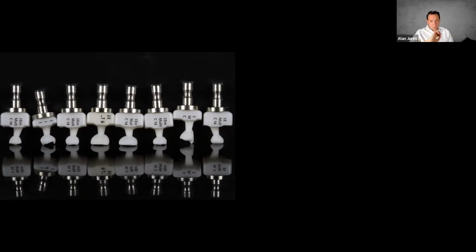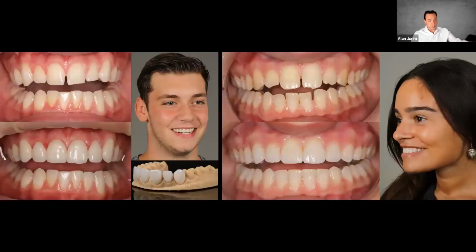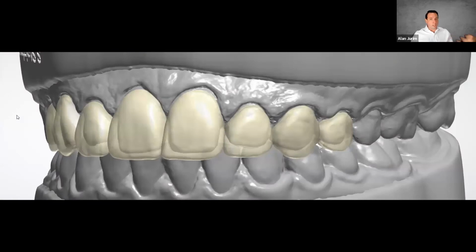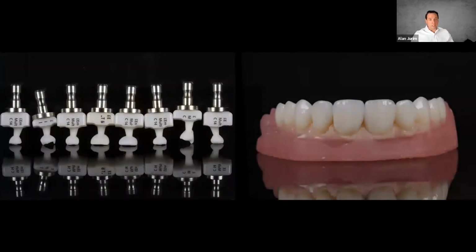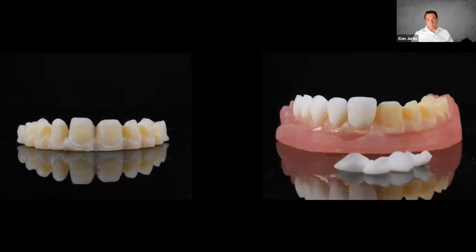So a case like this, we then create the resulting veneers, and then that can be touched up on a cast where they can be cut back and added porcelain to. In fact, one of the things that I found interesting was that we had a lot of patients who would look at their case on top of either a tan model, or sometimes we'd have models that would print in gray, and they would look at the final veneers and say, why do they look so dark, and get worried. And so with all the different resins we have, I decided to get creative and actually print a model where we printed the teeth layer in A2 resin that matched the base shade of the patient's stump shade.